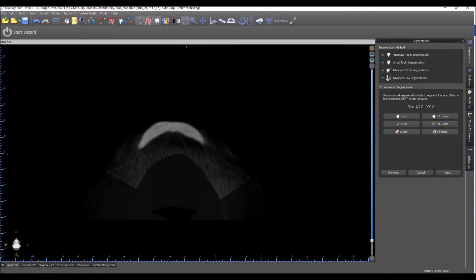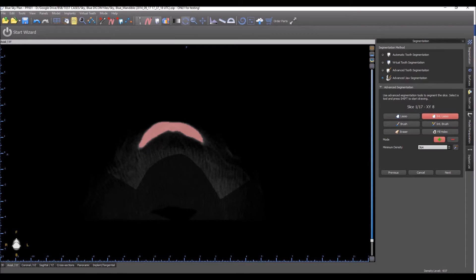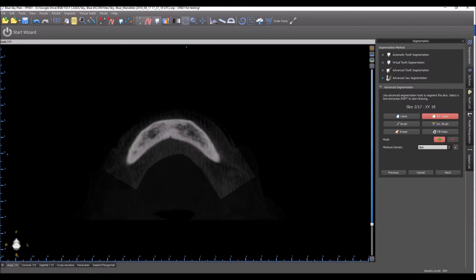The software is going to take us through several different slices where we're going to identify and define where the bone is, using the tools in the segmentation panel on the right side of the screen. We start with intelligent lasso, which allows us to lasso the relevant area so that only the bone over the minimum density will be selected. We can then start going through our slices.